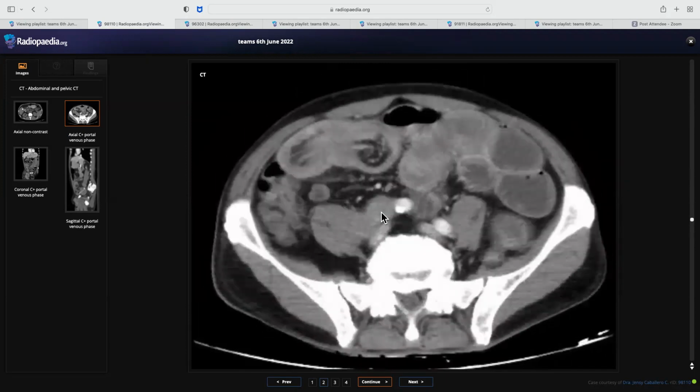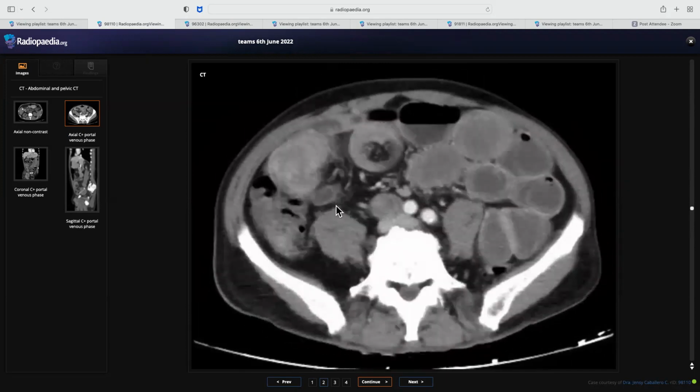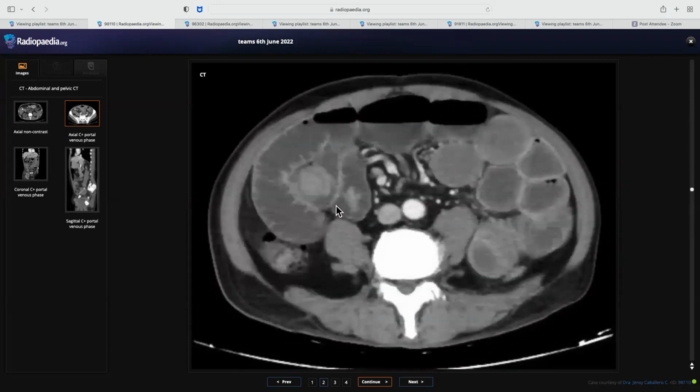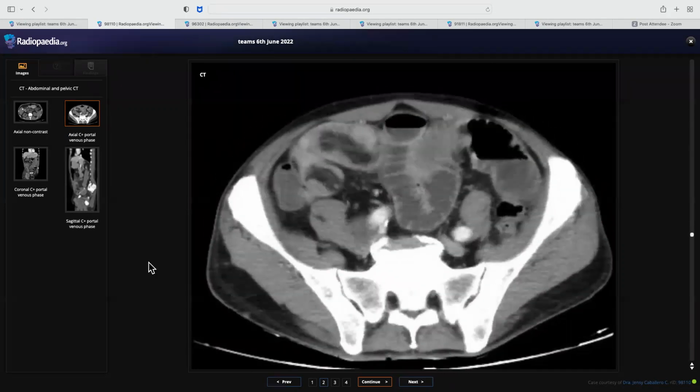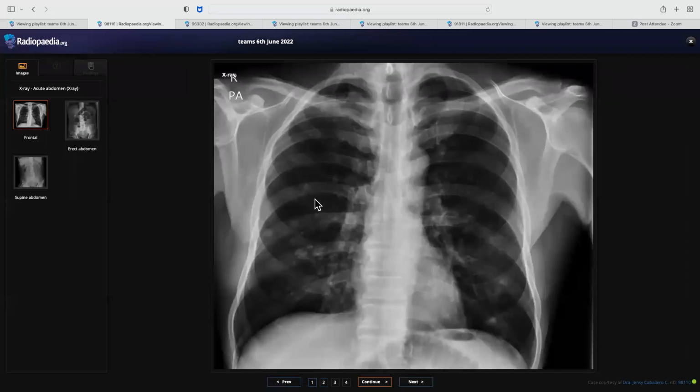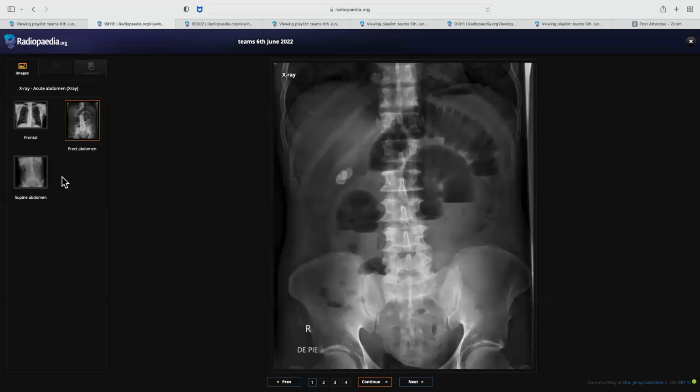This one was a case of malignant intussusception. You picked up the intussusception and told the lead point was malignant. Based on the chest radiograph, we knew that there are multiple lung lesions. So these are melanoma mets in this patient, and the obstruction is consequential to the melanoma mets in the bowel, leading to malignant intussusception. And of course, this patient will need immediate surgical management, which you also mentioned, urgently inform. Very well done, Dr. Maria. Thank you.